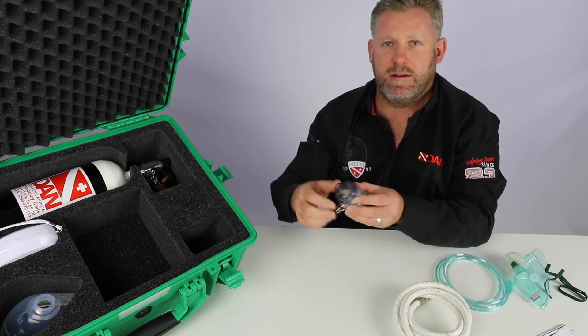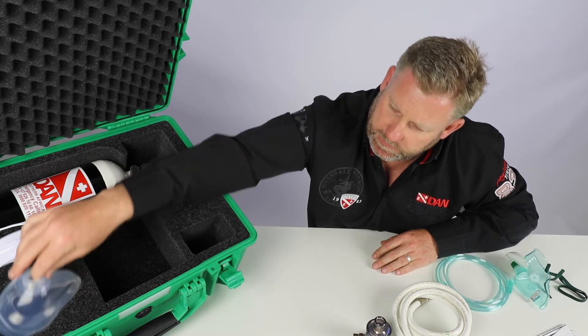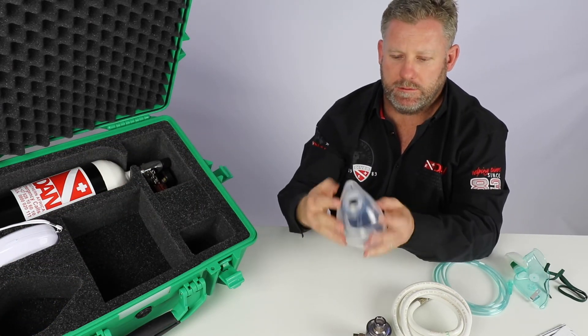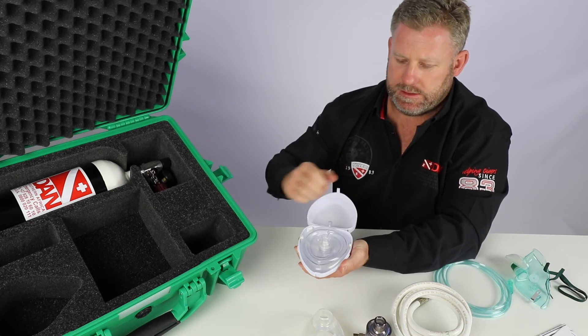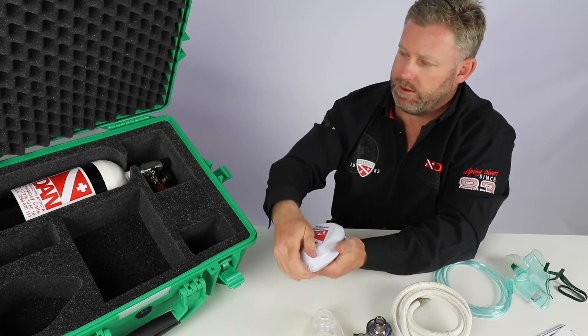We have our demand valve and this fits onto the true fit mask over here. That's your true fit mask — this would be for a breathing diver. And then we have our pocket mask over here that you guys have seen before.